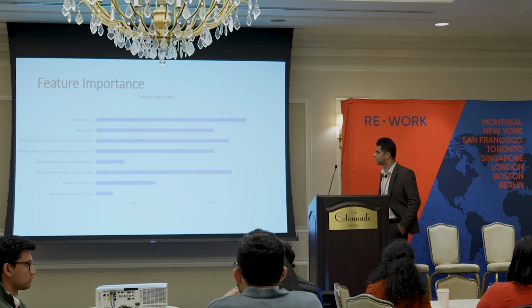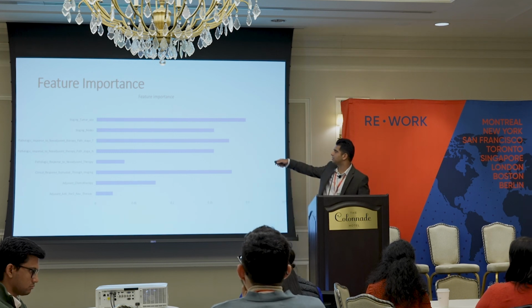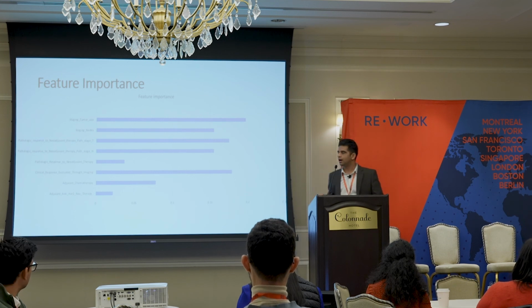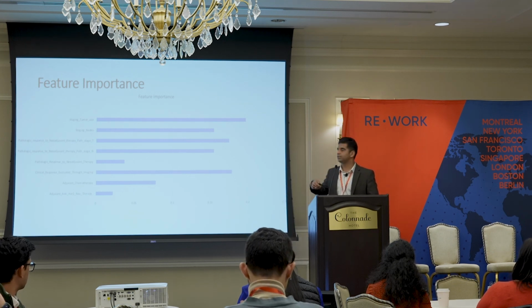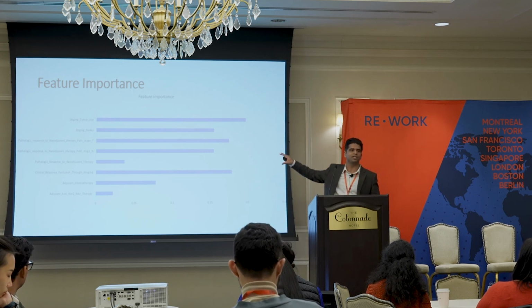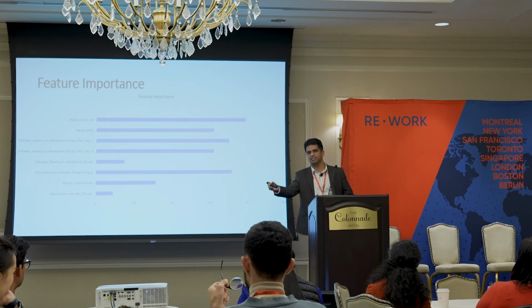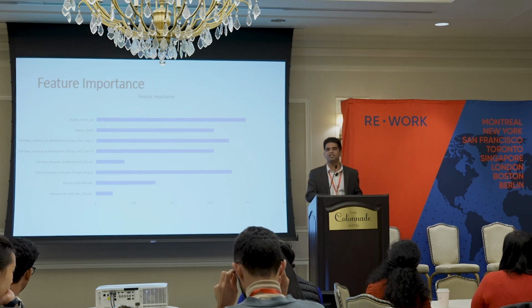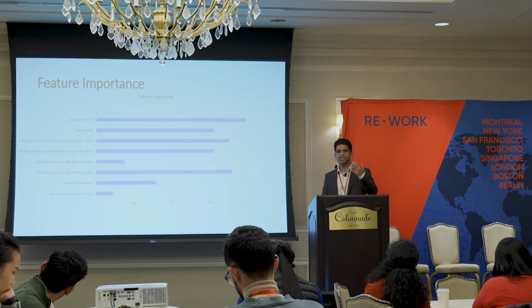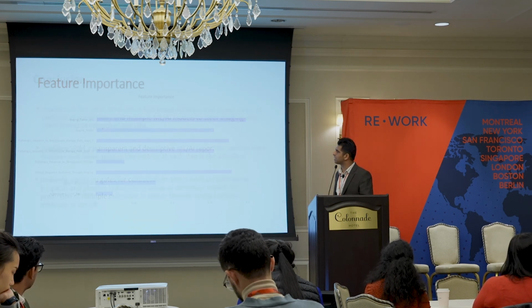So this study is still in process, where you could see this feature importance graph showing that not all the features, for example the therapy features, compared to the tumor staging features that get evaluated in pathology, are equally relevant. The tumor staging features are getting the high scores. So this is the plot that you get from the data sets in ImaGene, so that you could evaluate and then start removing features, as Rajesh mentioned, or start including more features to see how the model performs. And then you can do rounds of experiments to see whether you get to the goal of achieving high performance for these kinds of models.